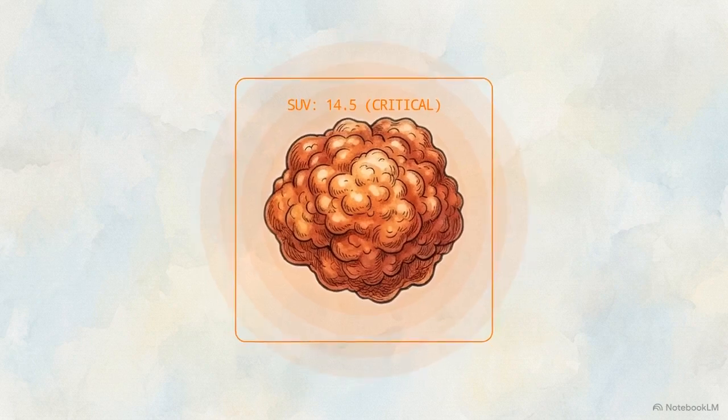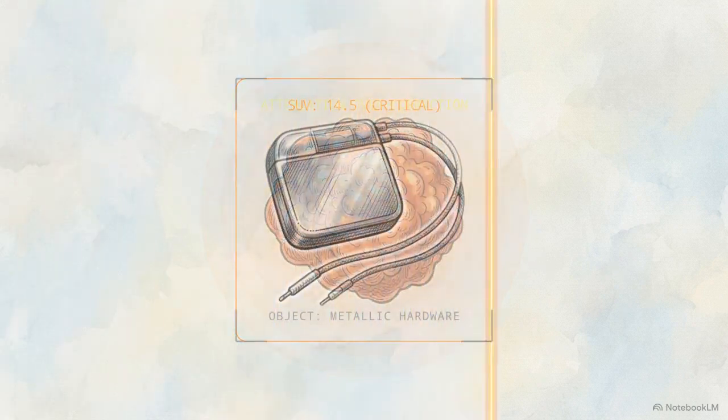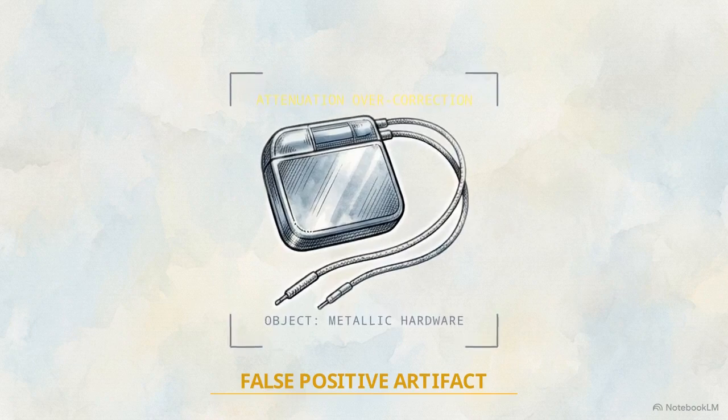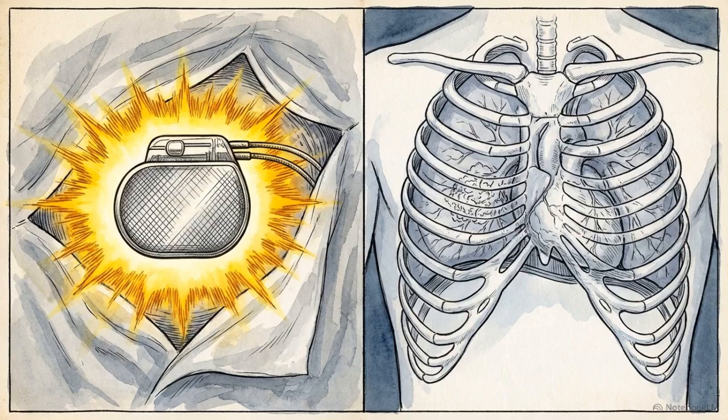Except there is no tumor there. That glowing mass is a complete fiction generated by the machine's software in response to a standard metallic pacemaker. The hardware algorithms and metabolic pathways engineered to isolate malignancies are highly volatile. When perturbed by common physiological states or foreign hardware, they routinely manufacture severe false positives and mask deadly false negatives.